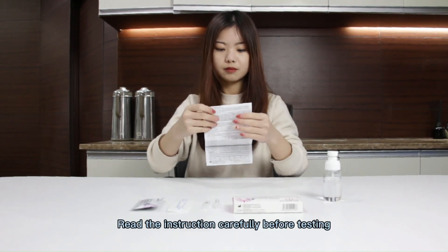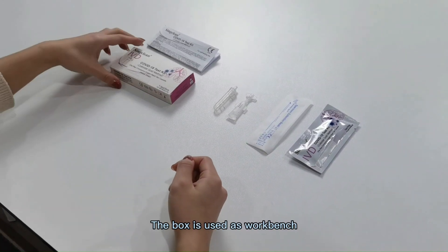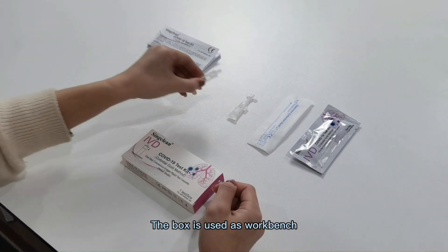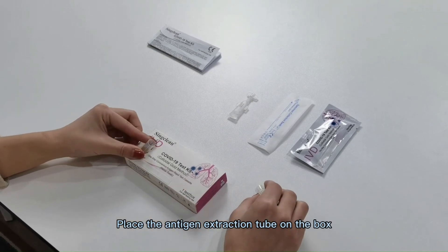Read the instructions. The box is used as a workbench. Place the antigen extraction tube on the box.